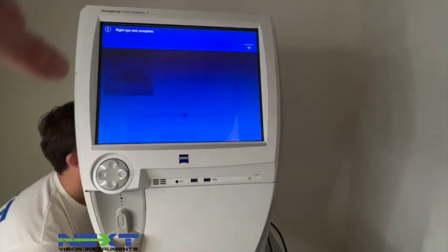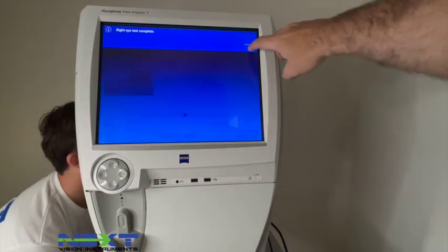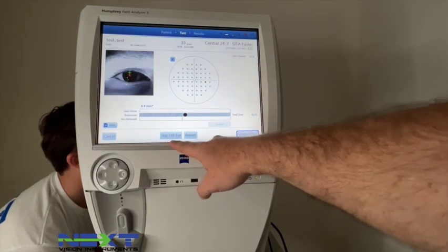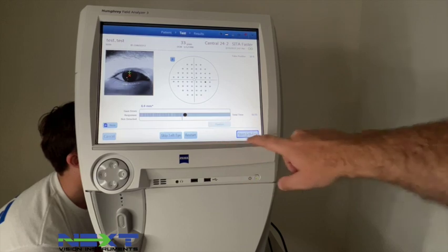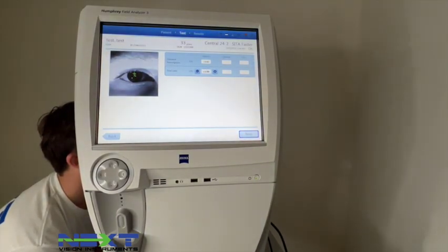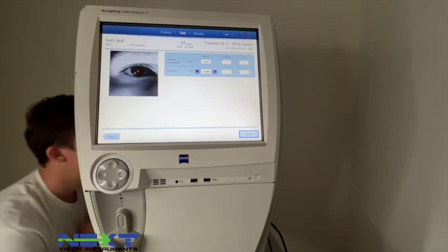It will say Right Eye Test Complete — select OK. You can then either skip the left eye, restart the right eye, or click Start Left Eye.